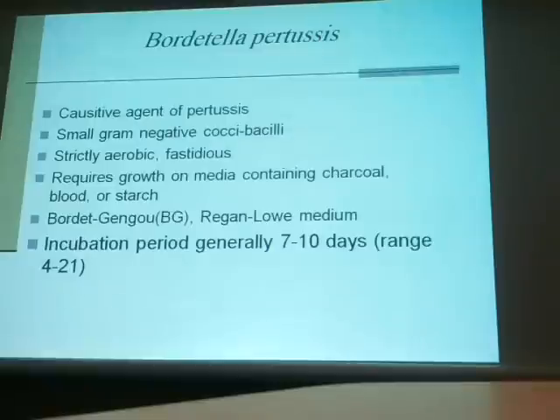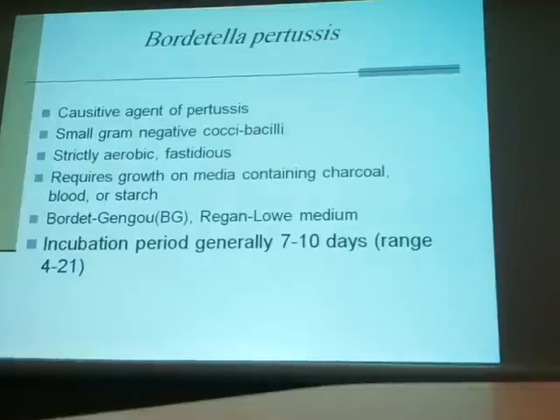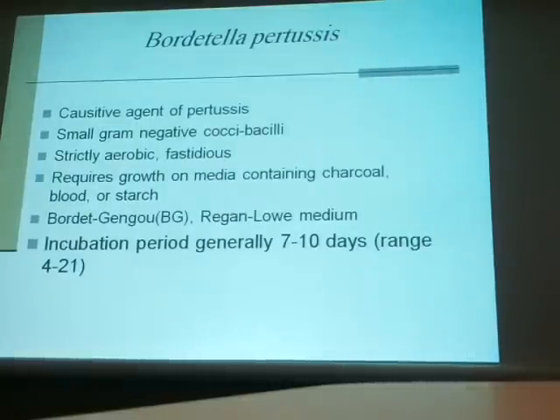Bordetella pertussis, which causes whooping cough or pertussis disease. It is a gram-negative coccobacillus, an aerobic fastidious microorganism, so it needs a special supplement to grow. It grows on Bordet-Gengou media. This media contains blood, glycerol and potato. Or nowadays they use Regan-Lowe media, which contains blood and charcoal.